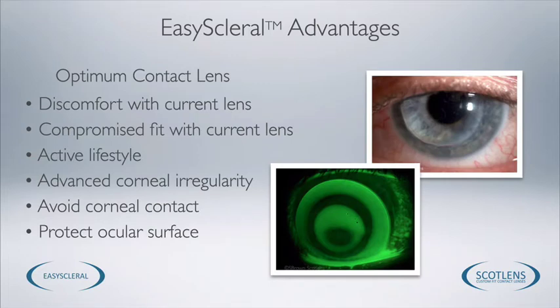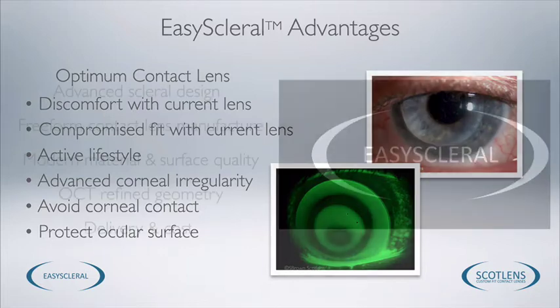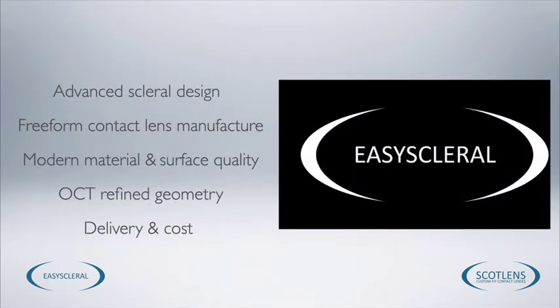EasyScleral lenses have typically been reserved for the most irregular corneal conditions that we face. But because they're a very comfortable lens to wear and because they can prevent centration issues and fitting issues that we have with other types of contact lenses, they're becoming increasingly popular for even mild to moderate corneal irregularity. Because there's a captive tear layer between the cornea and the contact lens, they can be a useful lens for conditions where there's ocular surface disorders.